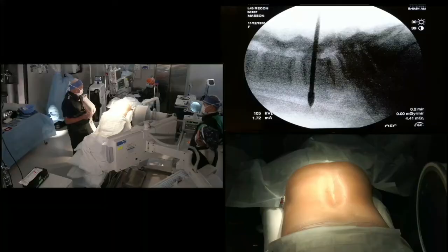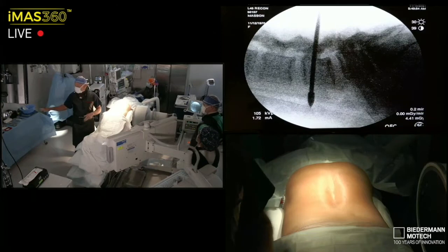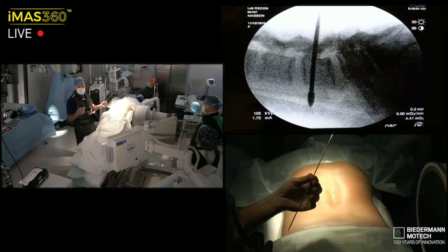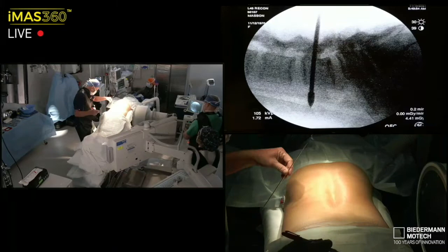All right, we're in the operating room at our surgery center. We've got everything positioned. Table, fluoro coming from the patient's right, micro coming from high left, small back table setup. This is what I consider, as previously stated, the most important part of the case. This is where I'm getting my three-dimensional representation of where I am in space relative to the back, relative to the zone, what the angles of attack are. And this is really where I set my own registration.